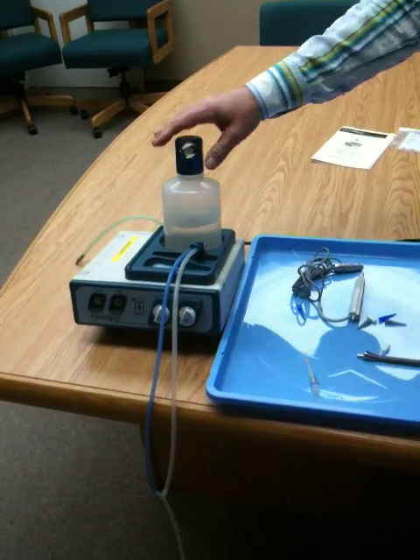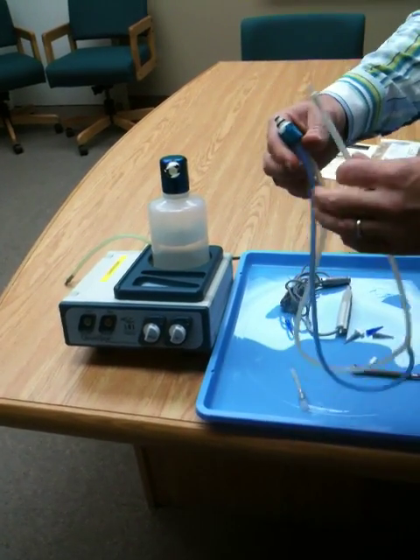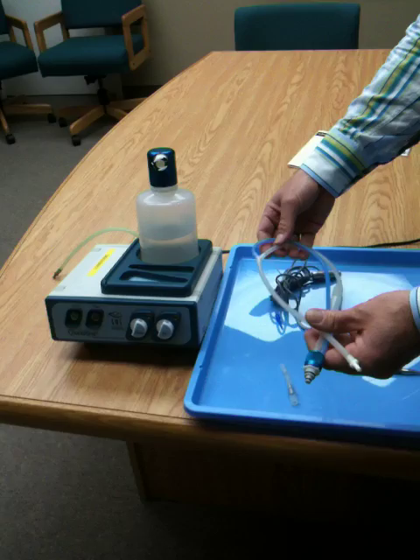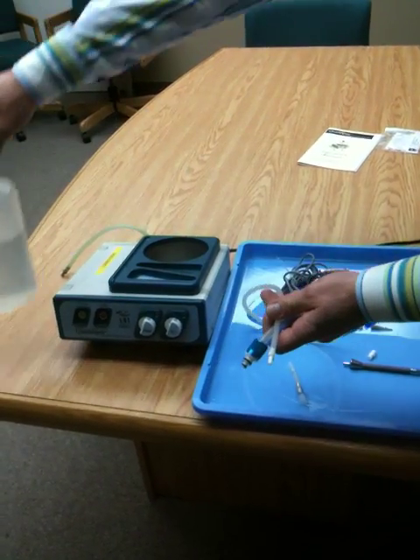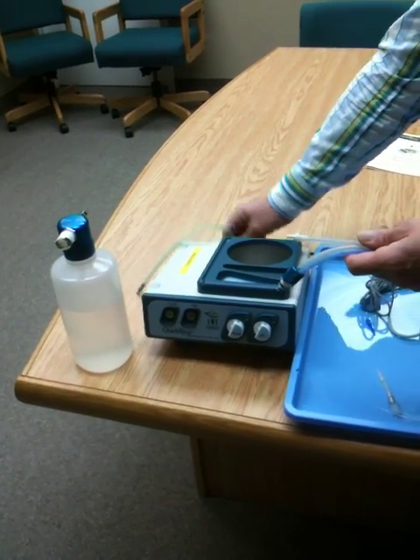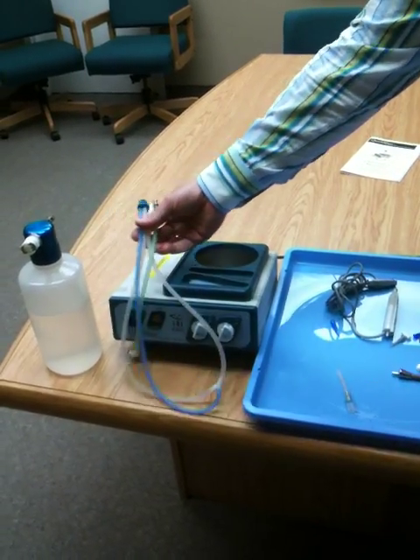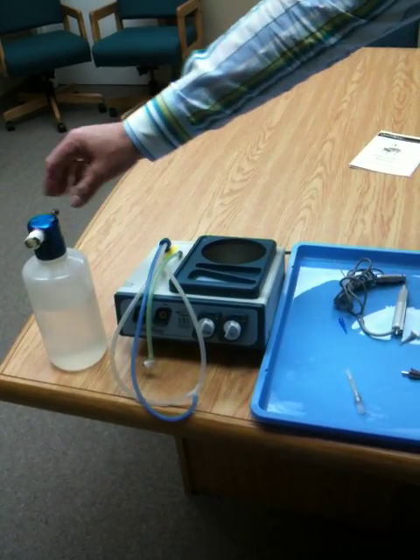The last thing is cleaning and autoclaving the unit. Because this is a pre-cleaning procedure, it's not necessarily required that you sterilize all these items. However, the bottle, the cap, and all the tubing are autoclavable and you can sterilize them. The more you sterilize them, the quicker the plastic and silicone will break down.